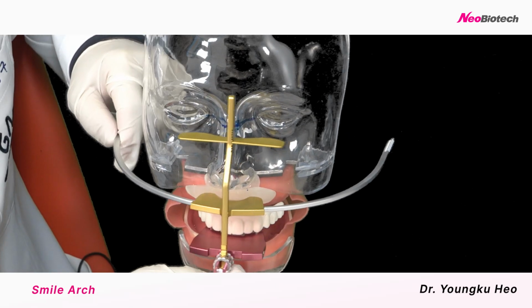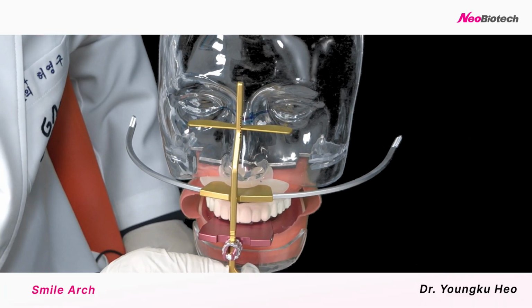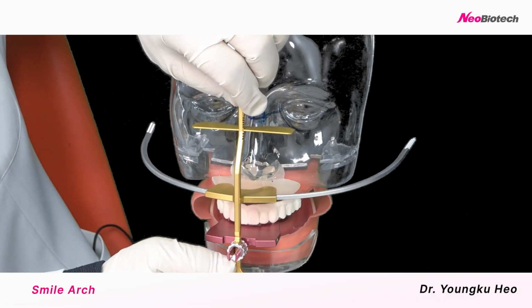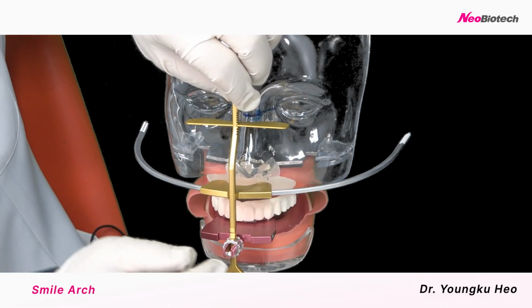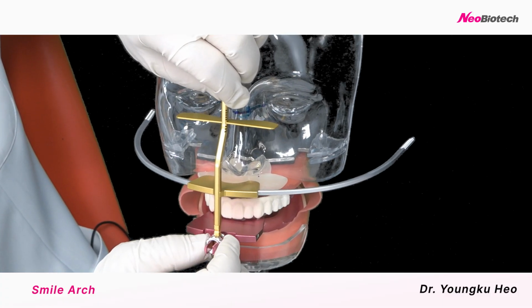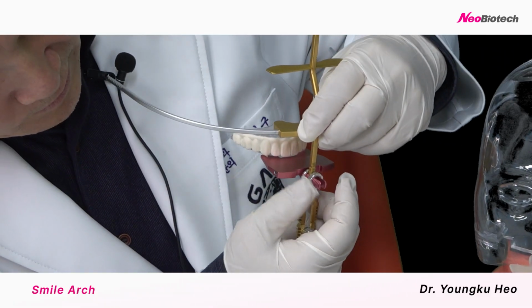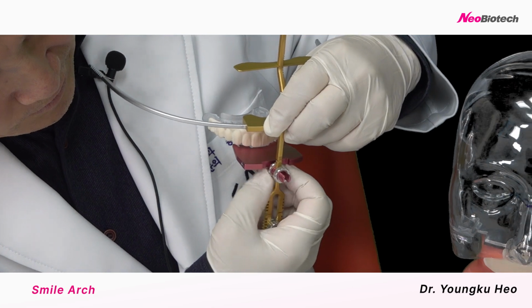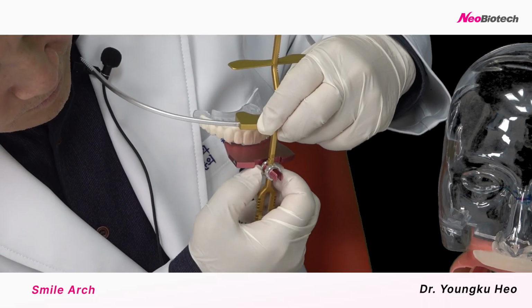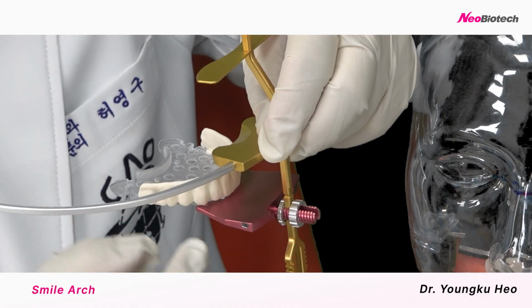You can put this in the mouth and let the patient bite, the patient smile, check everything, and also we can lower or raise these teeth by changing this line, upper and lower. All right, and also you can move this, so you can determine the anterior posterior position of the teeth.